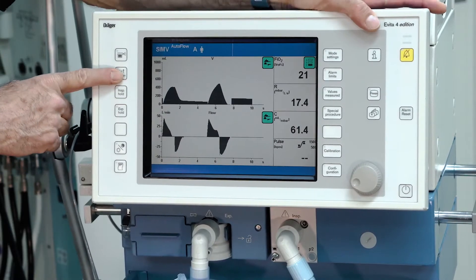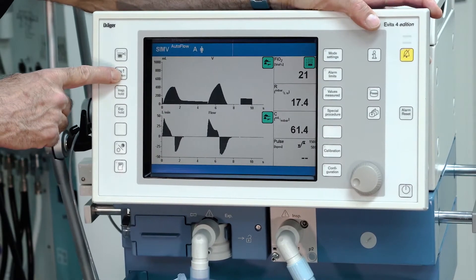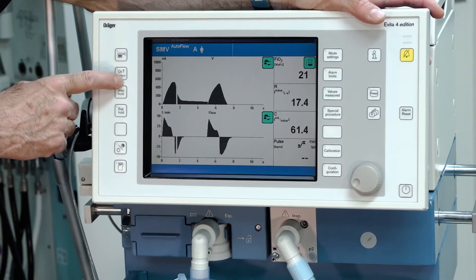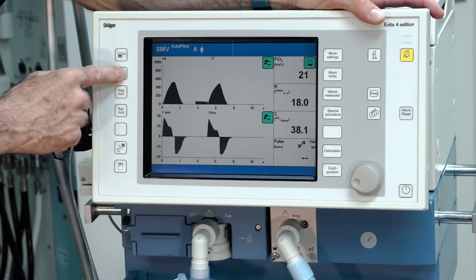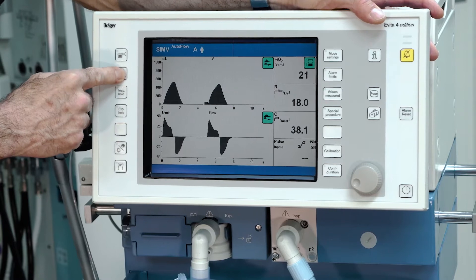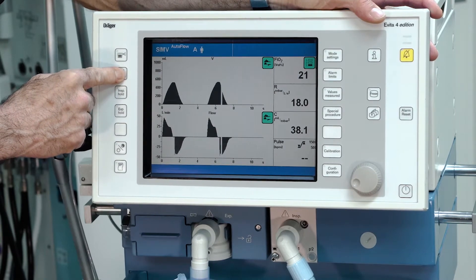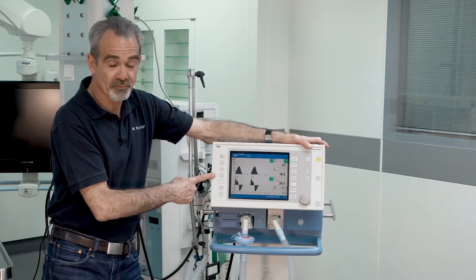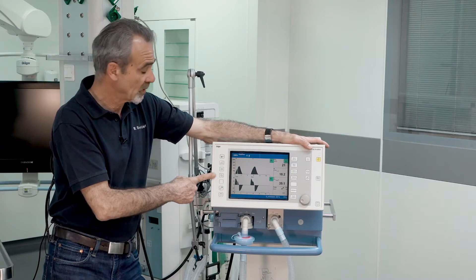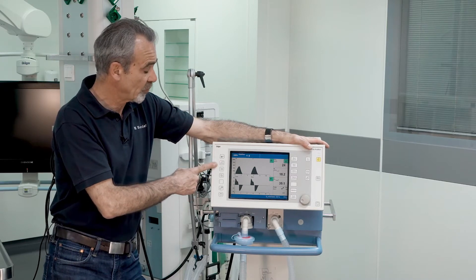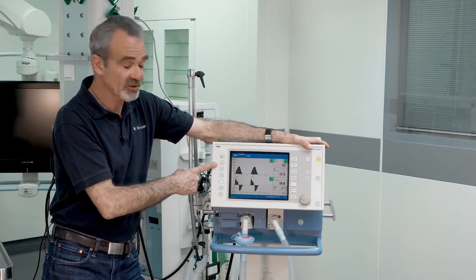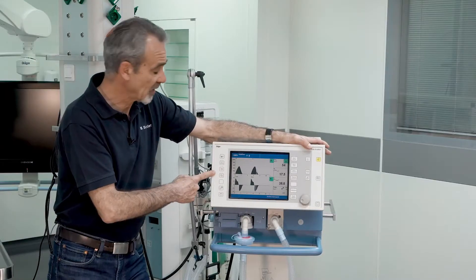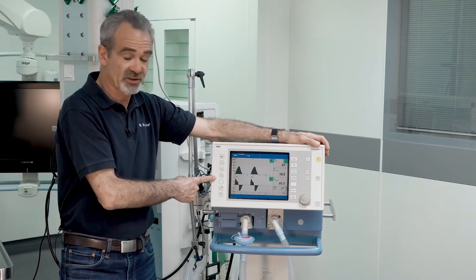The next key is the O2 suction function. For entering the O2 suction menu, press the button for three seconds and the O2 suction mode is on. If you want to finish the O2 suction, press the button again and the O2 suction function is finished.